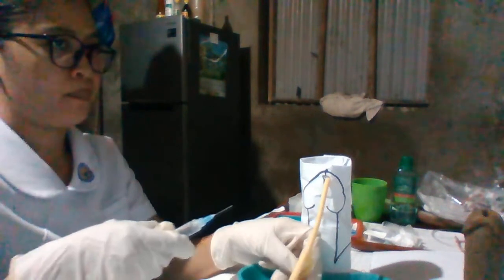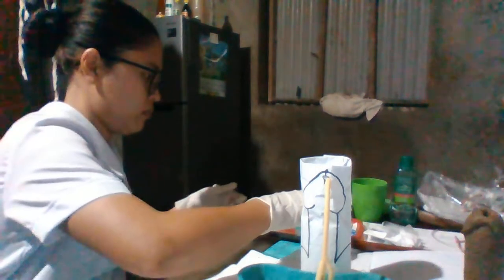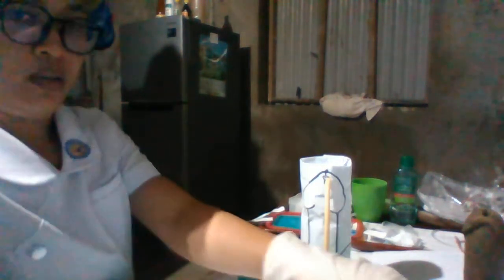Then attach the end of the catheter to the collecting tube. So we're going to attach this one into the collecting bag.